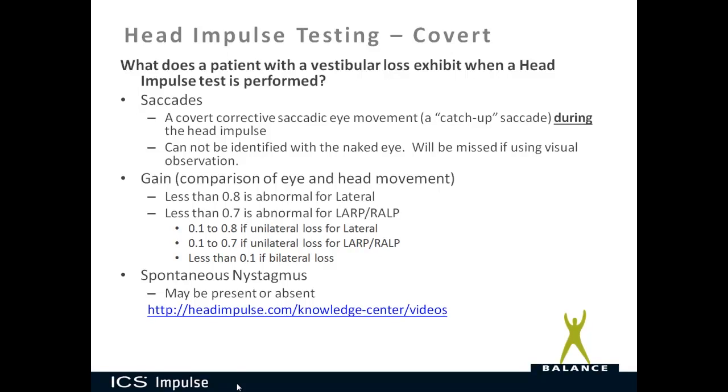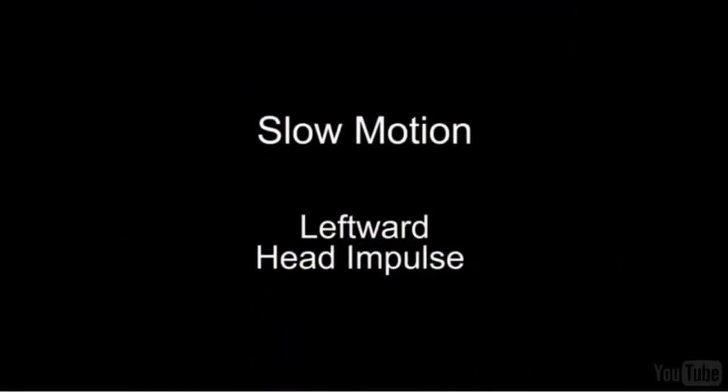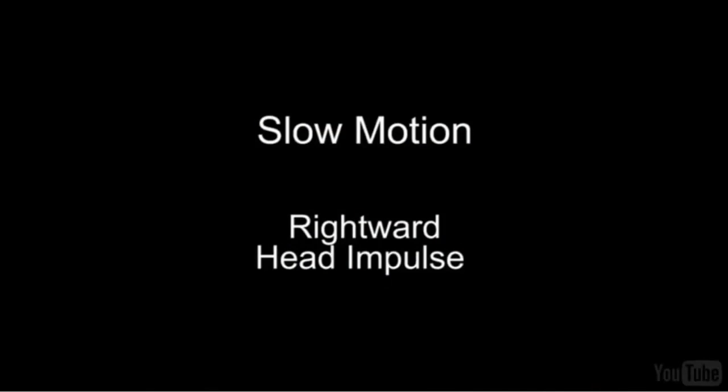Looking at video from headimpulse.com showing covert catch-up saccades: at normal speed, it's very hard to see them with visual observation. When the video is slowed down, you can see the head moves and then there's the catch-up saccade occurring during the head movement.